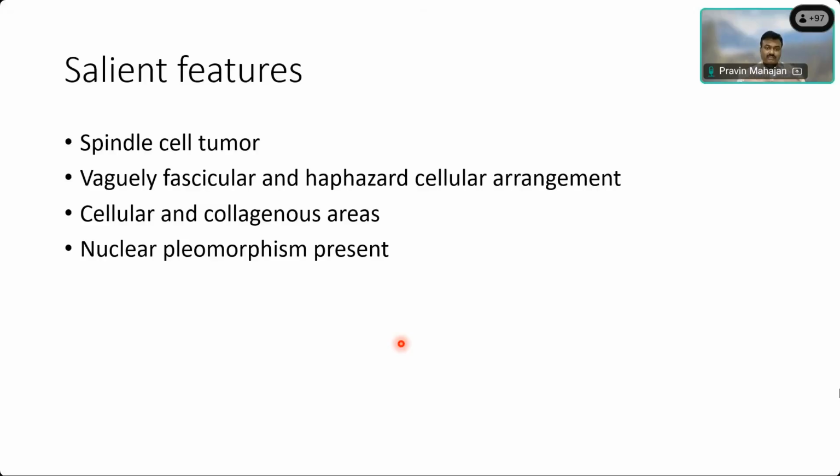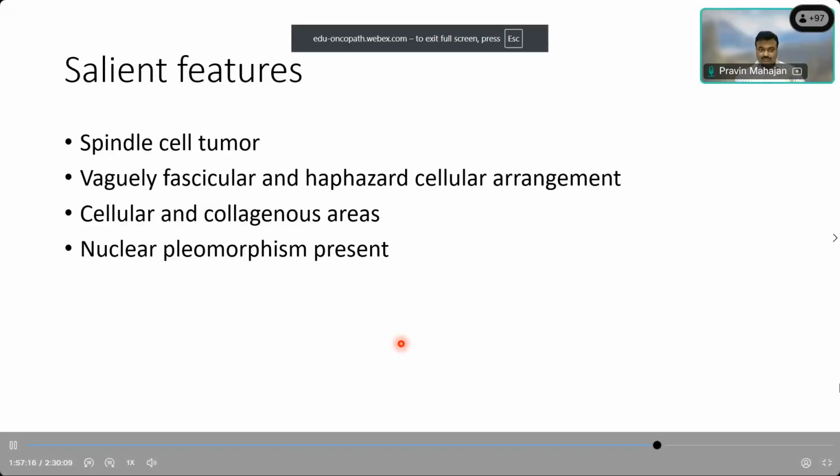So now this is a peritoneum, right? What will be your differential at this site? An intra-abdominal peritoneal-based sarcomatoid tumor, which we think is a malignant or spindle cell tumor. What will be your differentials?